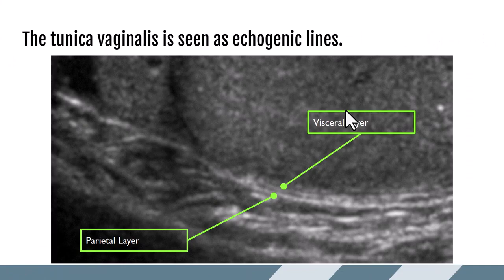This is a close-up of the tunica vaginalis. It comes in two layers: the parietal layer on the side of the scrotal wall, and the visceral layer on the side of the testicle. The tunica vaginalis produces a small amount of fluid, which is what we see in between those two echogenic lines. A little bit of fluid is normal; a lot of fluid is considered pathology. This picture nicely shows those two parallel lines on either side of a trace amount of fluid.